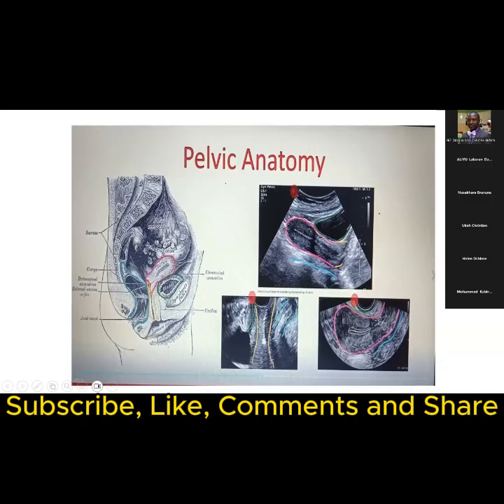The same image is displayed here, but this time the endometrial thickness is quite defined. Usually what you find in the mid-cycle period where you have a trilaminar pattern. And so you can do a measurement from the top here, which is anterior, to the bottom here, which is posterior. And that is the thickness you will be interested in.